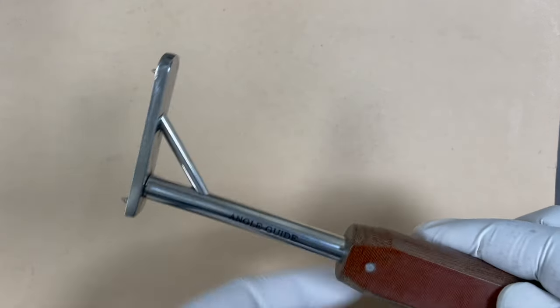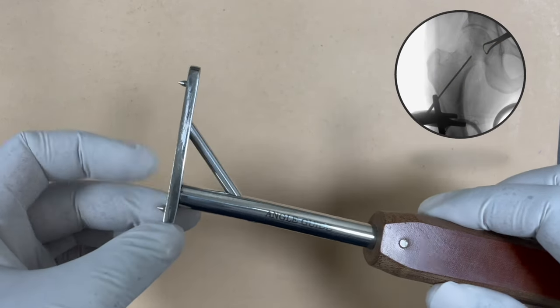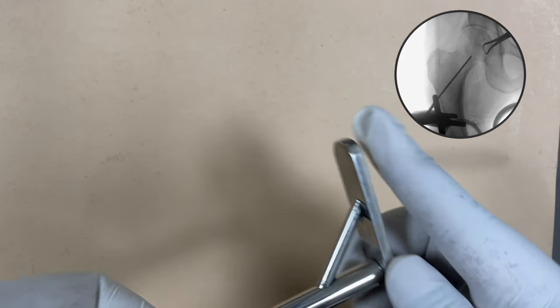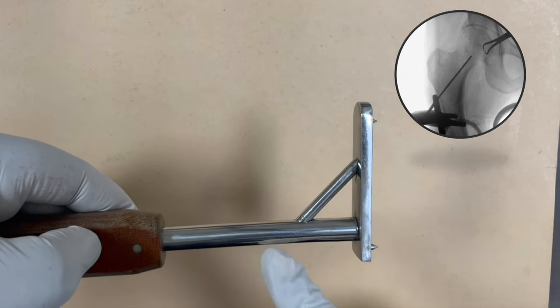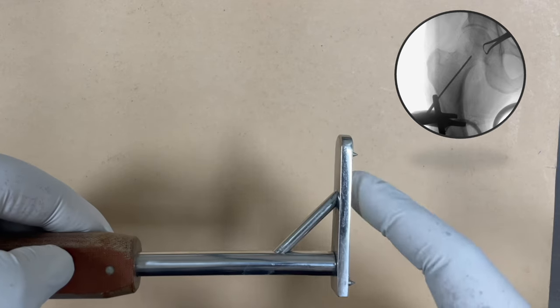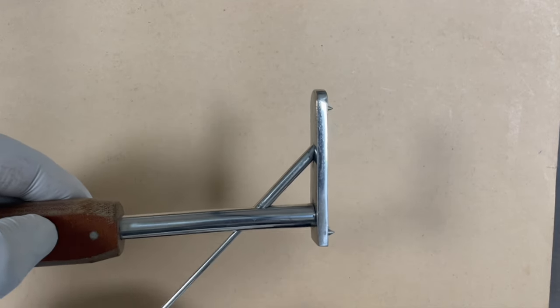The first instrument that we use is the angle guide. The angle guide is used for placement of the guide wire for the lag screw. This hole is bent for placement of the guide wire, and you place this angle guide towards the lateral surface because this guide wire has to go in the subtrochanteric direction. This hole is meant for the guide wire and you drill the guide wire towards this track, so the guide wire passes like this.